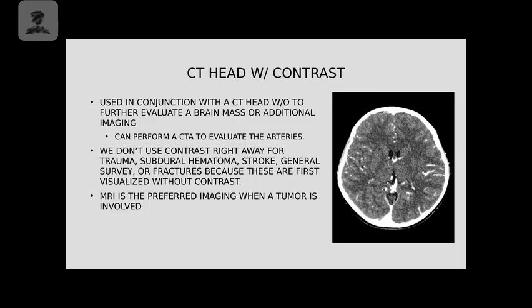They utilize a different type of imaging. So they're going to use a magnet, they're going to be changing the pulses to the machine, aligning the atoms in a different direction to get certain images. Versus us, we use the x-rays and are based on attenuation data. And so, with having the skull all the way around the outside, sometimes the brain matter doesn't always appear super pretty. So, MRI is going to be our preferred method for some of those things.